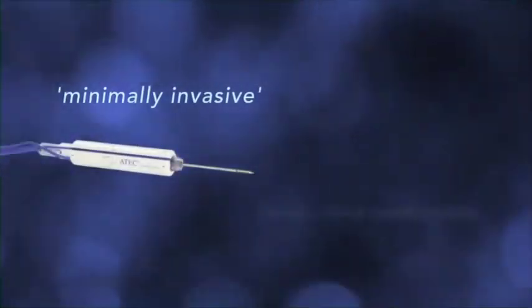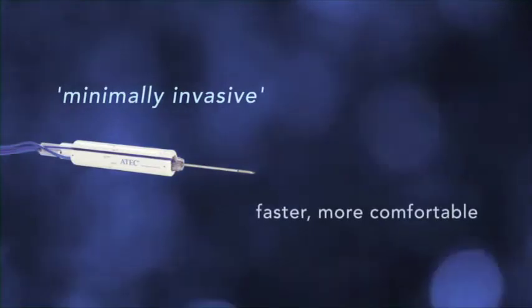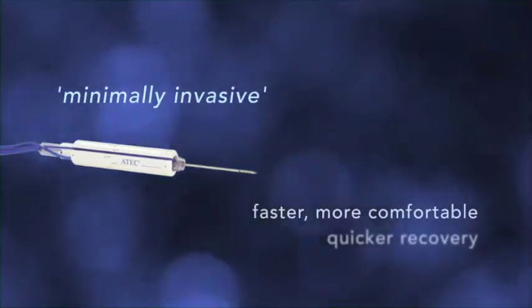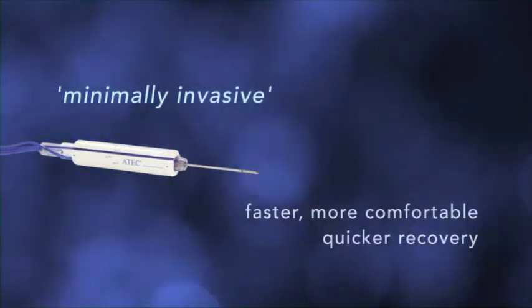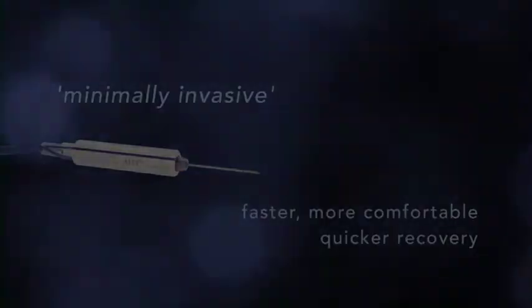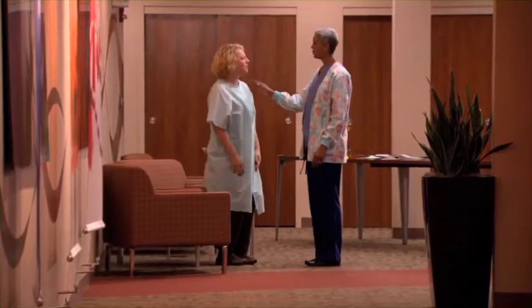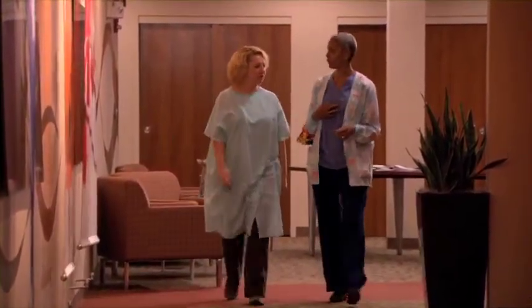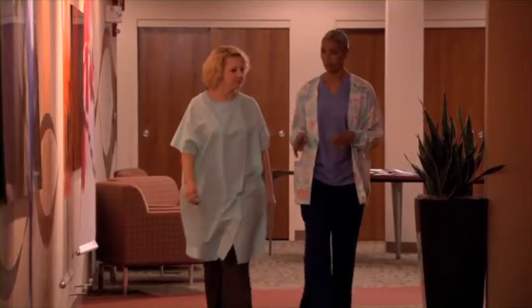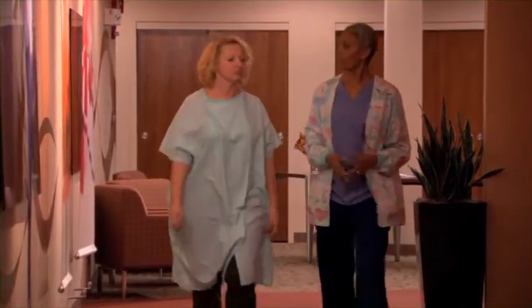Today, we have minimally invasive methods for sampling the tissue. That means we use a needle to take the sample with an imaging system for guidance. It's faster and more comfortable than open surgery, and your recovery time is much quicker. Of course, it's okay to be nervous about any medical procedure, but it's really not quite as scary as it sounds, and it helps to know ahead of time what's going to happen.